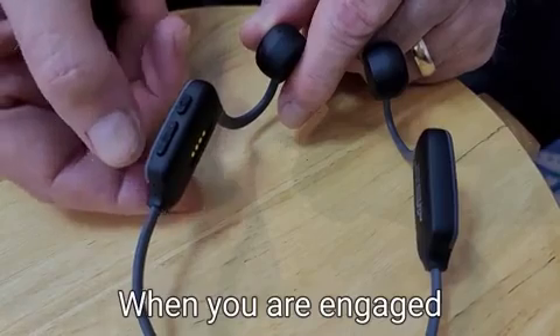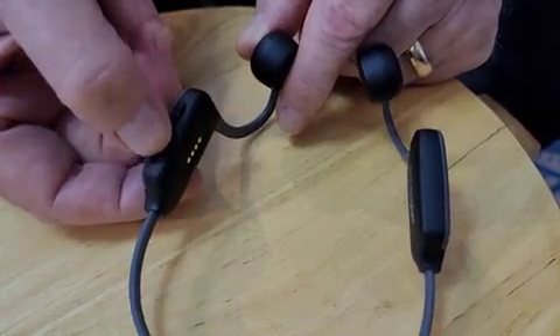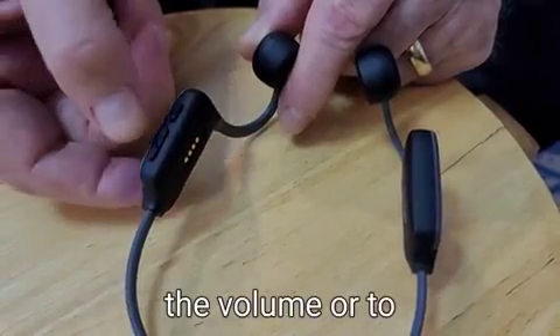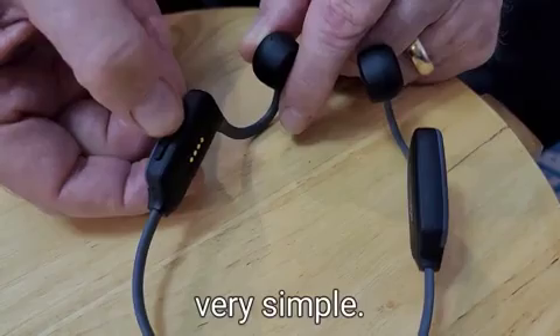When you're in hearing aid mode, you use the volume control to increase or decrease the volume. Very simple.